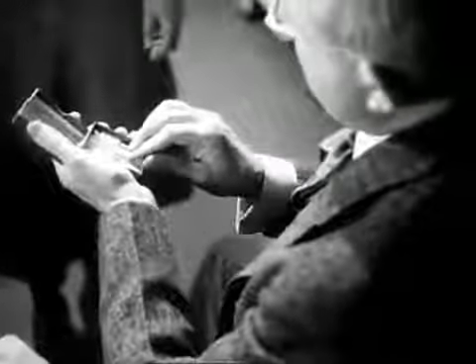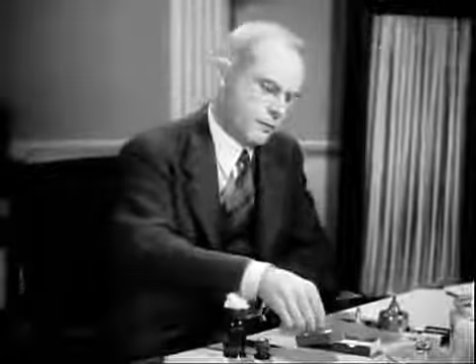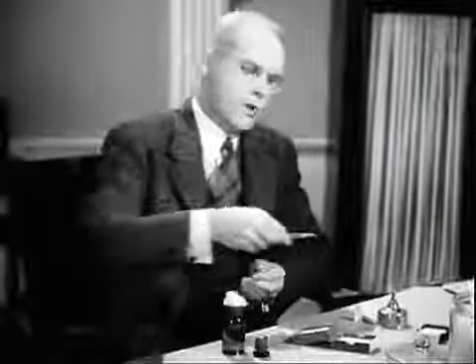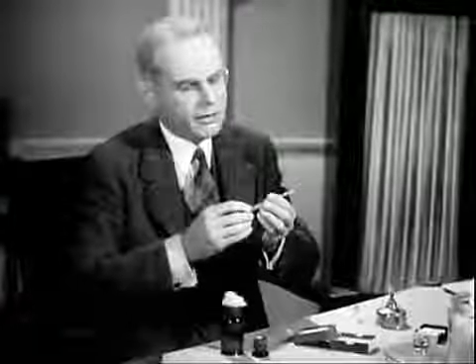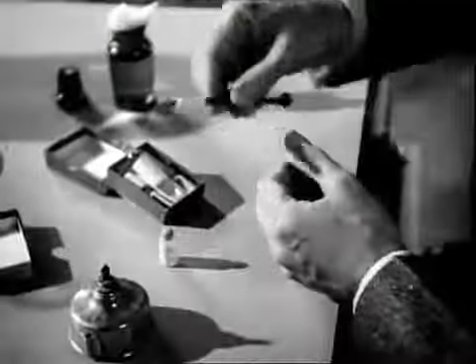When a tablet of the first strength is dissolved in 1 cubic centimeter of the saline solution, 1/10 of a cubic centimeter contains the recommended dose. If no reaction follows the use of the first strength, the test is repeated with the second strength. Use a 1 cubic centimeter tuberculin syringe that has been sterilized. Inspect the needle for sharpness. Flame it to make sure that it is sterile.